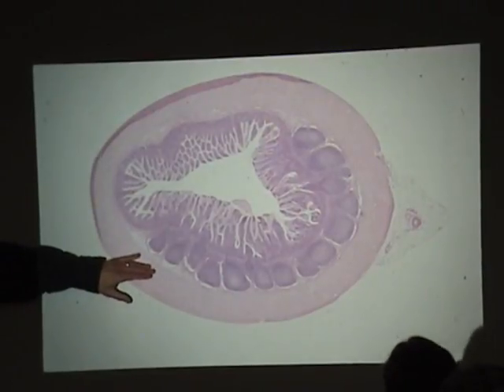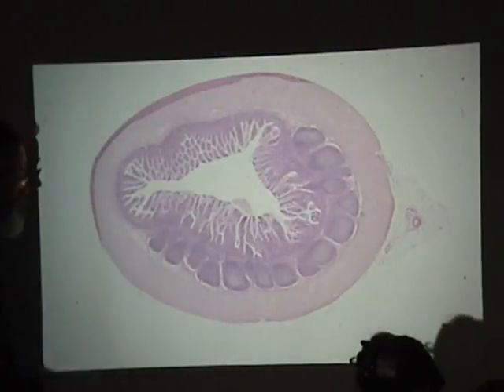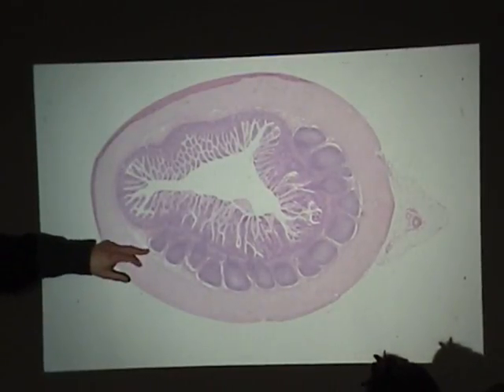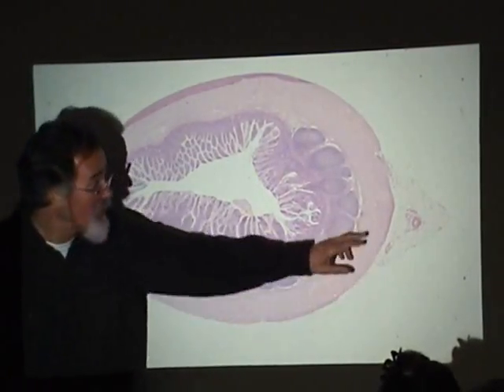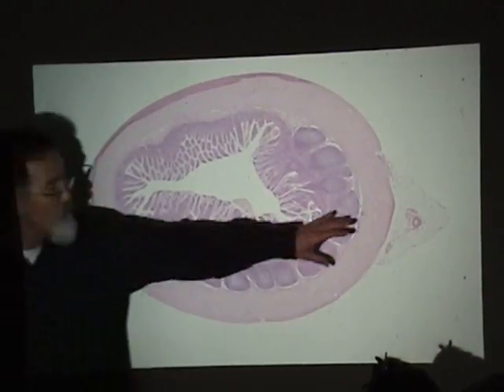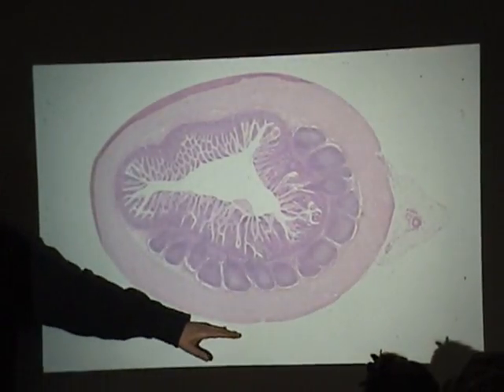Then we've got this region out here, which is called the muscularis externa, which consists of an inner circular, and this is by definition, because it's wrapping around the lumen, and an outer longitudinal layer. We know we can find the myenteric plexus of Auerbach in here. If we're lucky and have a good eye, we can find the submucosal plexus of Meissner. See this little bit of fat up here? If we were to look carefully here, we might see the nuclei of mesothelium, simple squamous epithelial cells. So this is kind of suspending here. If we were really lucky, we could pick up the serosa out here.